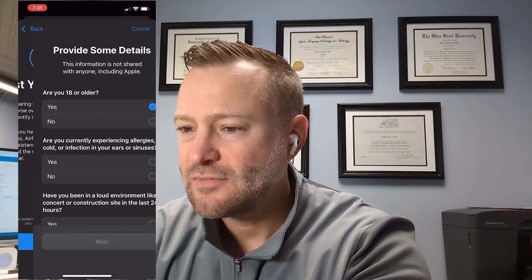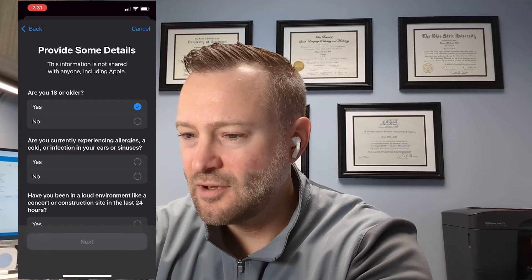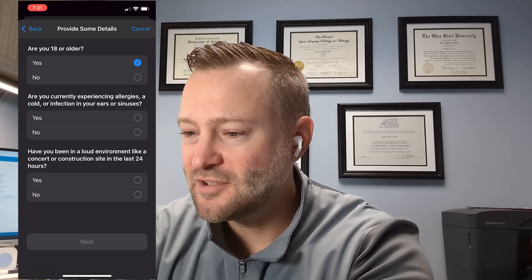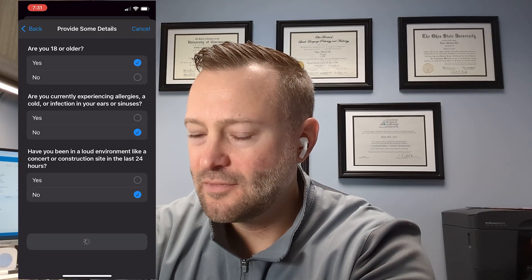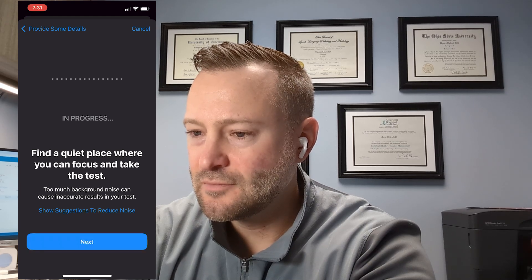I'm going to go down to take a hearing test. We click the button and hit get started. I'm 18 or older, I'm not currently experiencing allergies or anything in my sinuses, and I haven't been on a construction site in the last 24 hours. This is just assessing and looking at the noise level — I actually just had some dulling of the sound in my ears and you can see 'too much noise' because I'm talking, so I'll stop talking for a second.